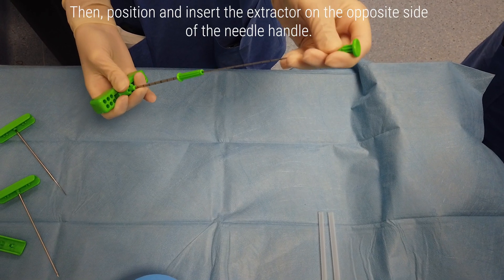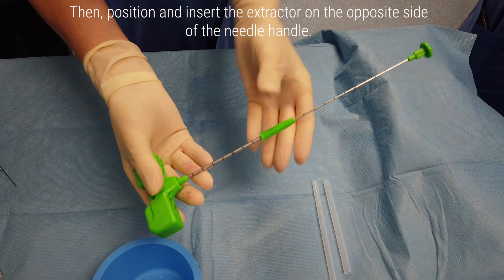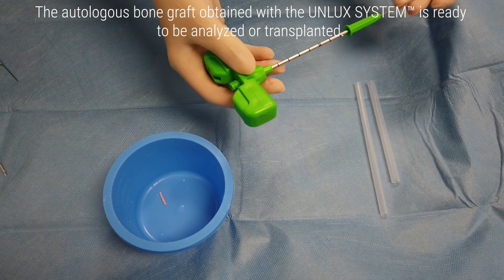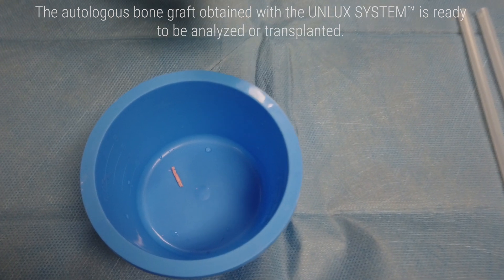Position and insert the extractor on the opposite side of the needle handle. The autologous bone graft obtained with the Unlux system is ready to be analyzed or transplanted.